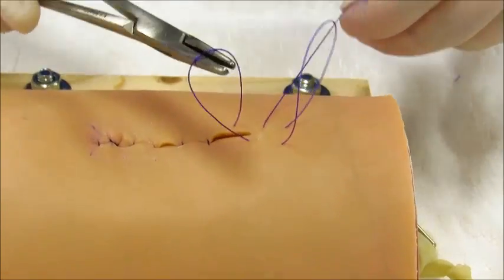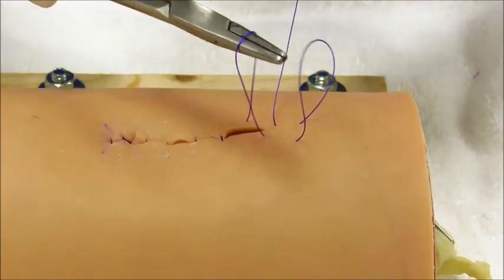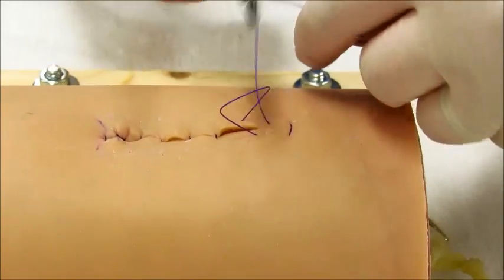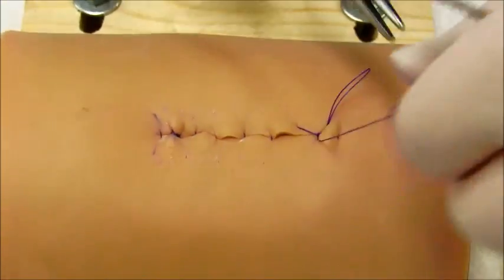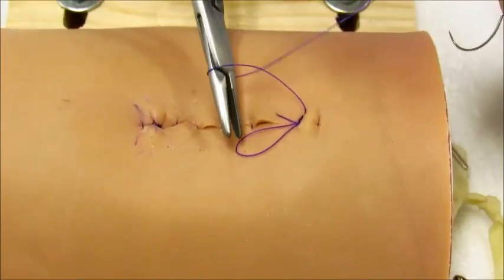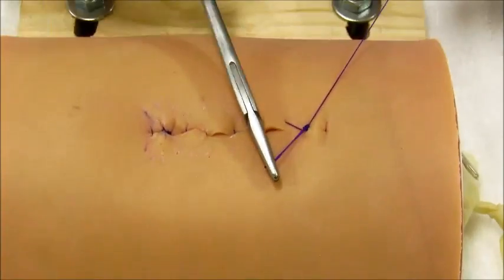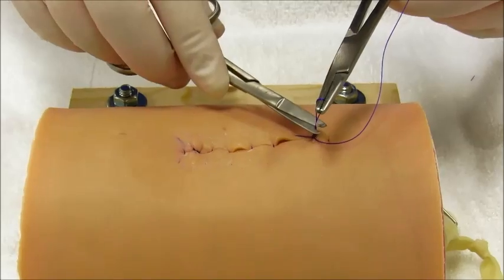So again, I have my 2 loops. This loop is going to be on the end and is going to help to bury that suture. So I'm going to pull that through, and that'll help to bury that suture down. Again, it buries a lot better on tissue that is nice and loose and like a hollow organ like the uterus or the bladder. But again, especially on the Cushing, you'll probably have your knot sticking out just a little bit, and that's okay.